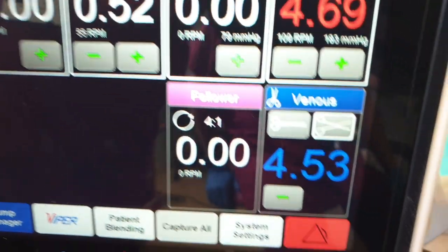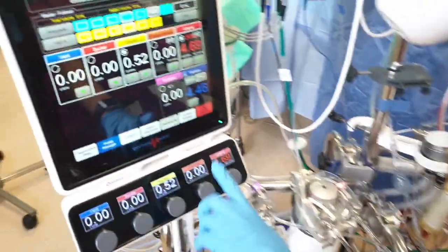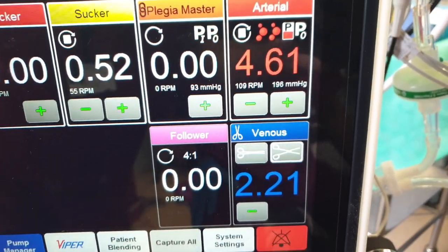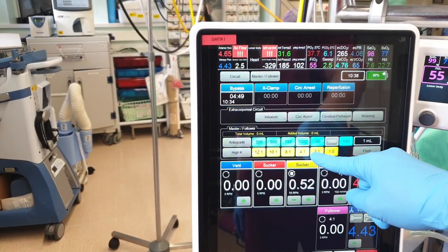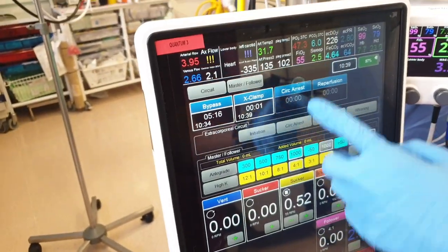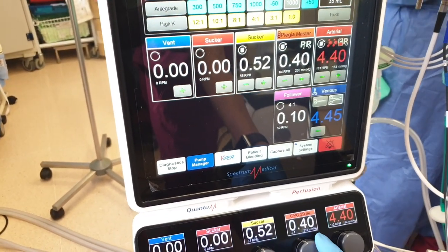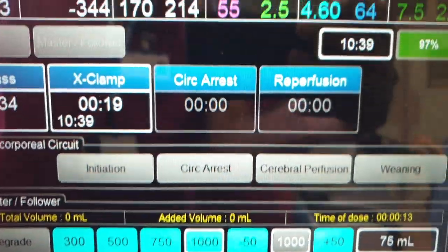That's full flow. Flushing. Yes, happy? Thank you. Cheers. Yes, it's coming down. You need to set anything as long as you meet the requirement, and then the ball will back up. Giving flow down the route. Let's turn it on. Your valve closure, set it to your proper pressure. It's going now. Flow running well.